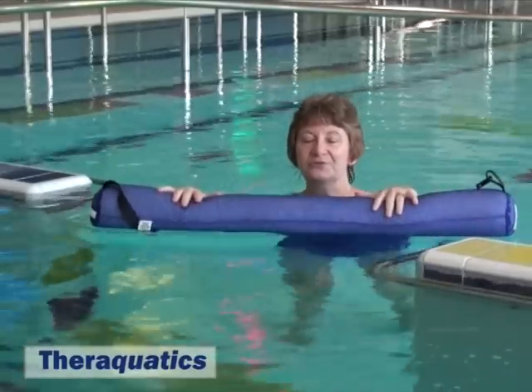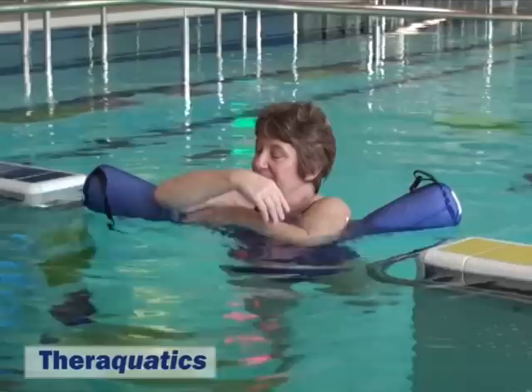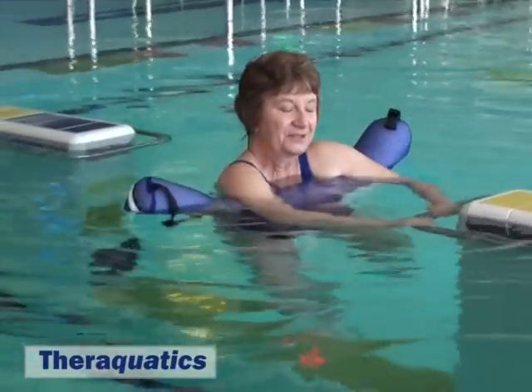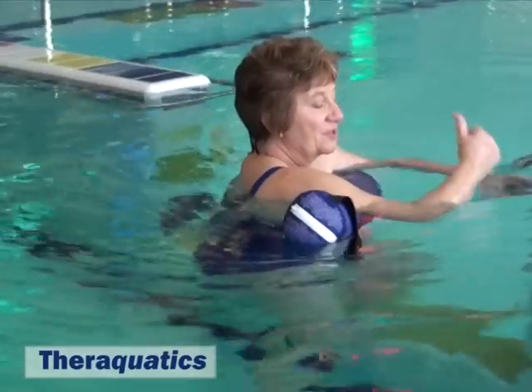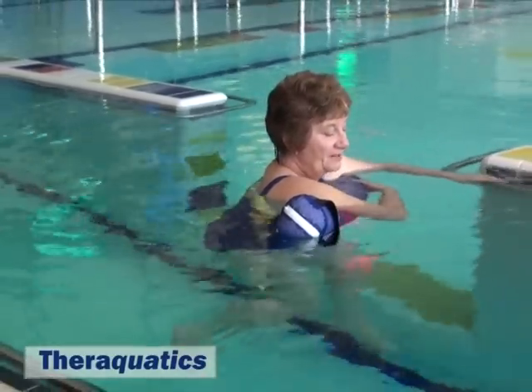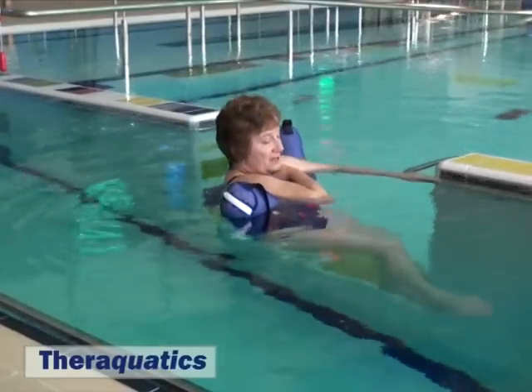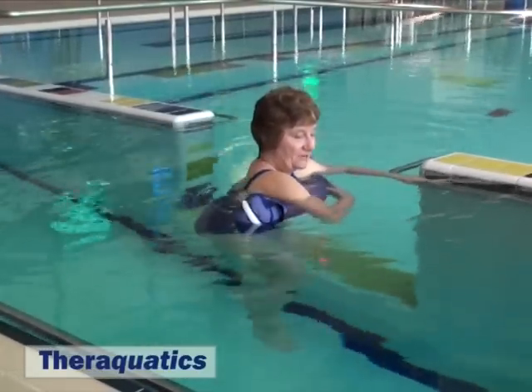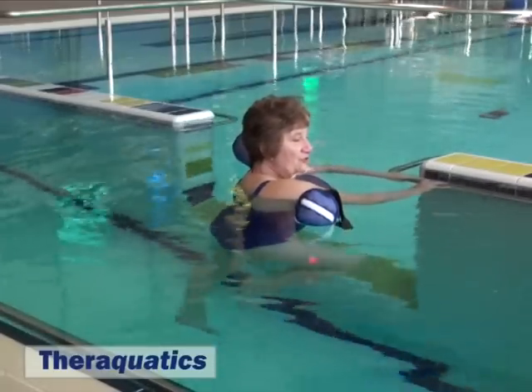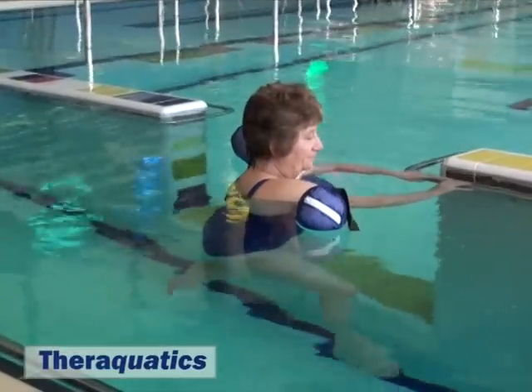The sausage float can be used in the deep water to do leg exercises. Placing it in the front of your body, under your shoulders, then coming into the deep water allows the body to hang vertically. If the float is behind, often people will lean too far back and end up straining their legs. With it in the front, they will hang in a vertical position which helps to stretch the hips and lengthen the legs down in the deep water.